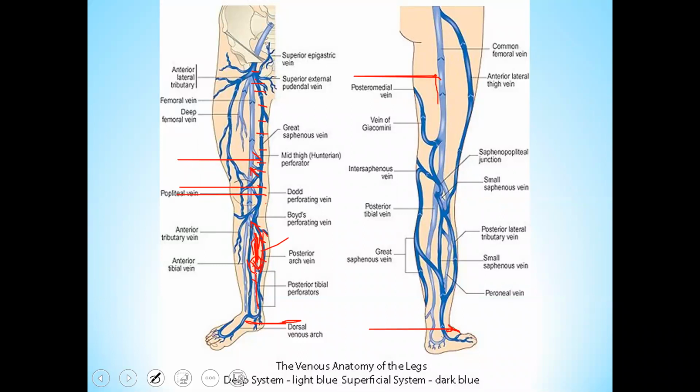And again, you can check the competency of these veins at different levels by Valsalva maneuver. So you should know about Valsalva maneuvers.